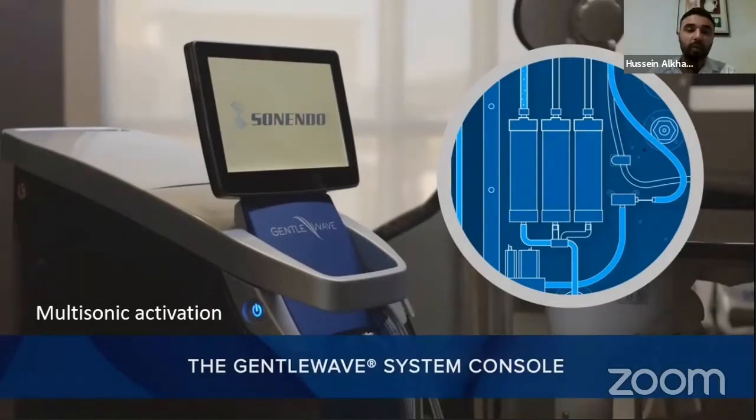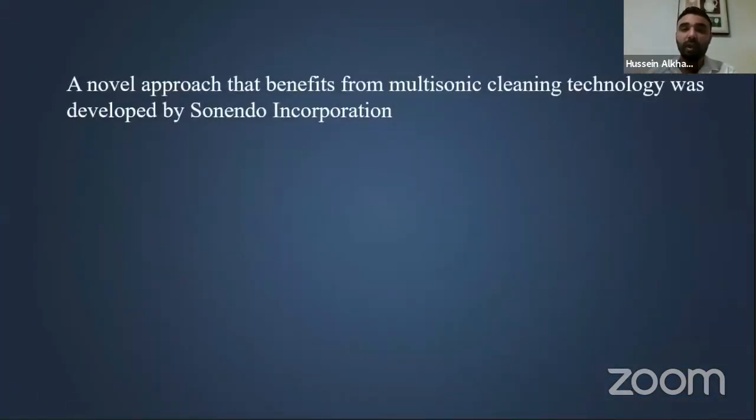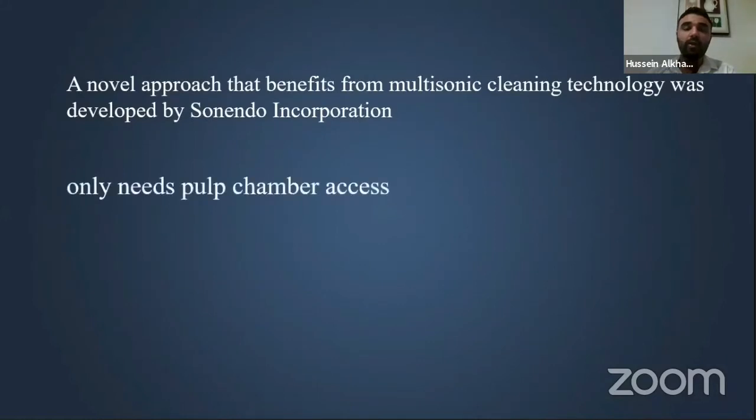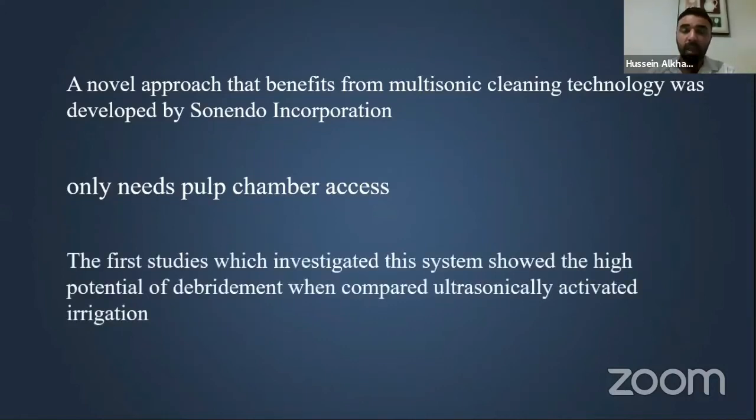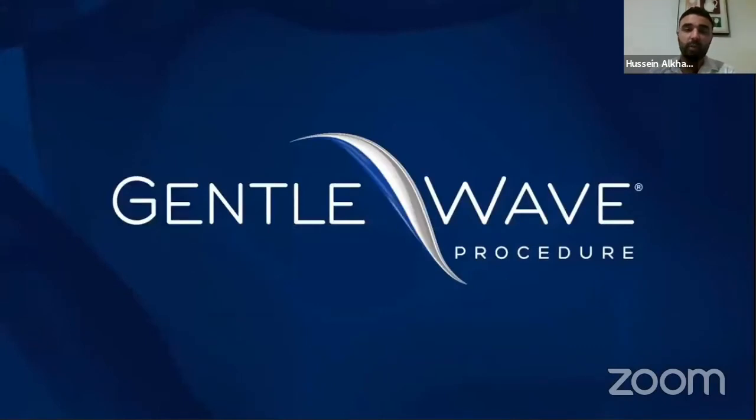Now, let's talk about the GentleWave system. This type of activation is called multisonic activation. This novel approach benefits from multisonic cleaning technology, and it only needs pulp chamber access. This type of device was aimed to fulfill the requirements of minimally invasive endodontics. The first studies that investigated the system showed a high potential of debridement when compared to ultrasonic activated irrigation. In this video, we will see the GentleWave procedure.